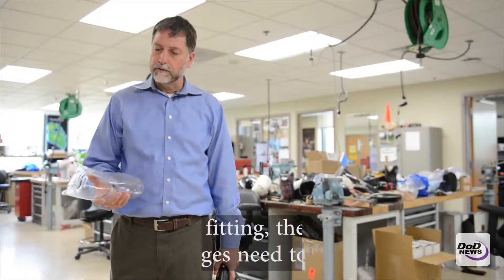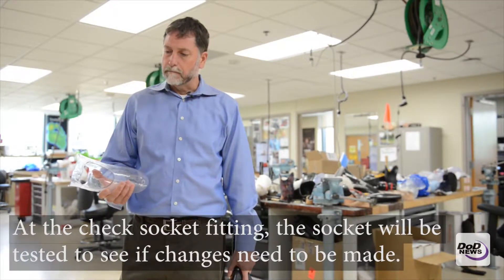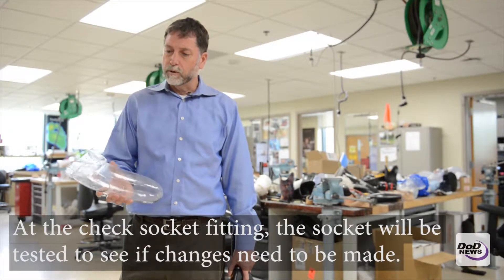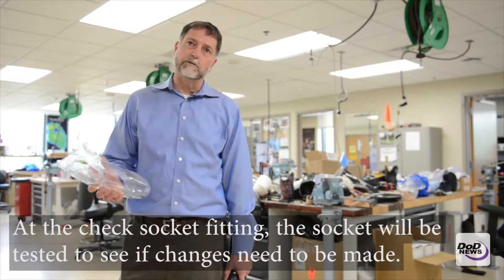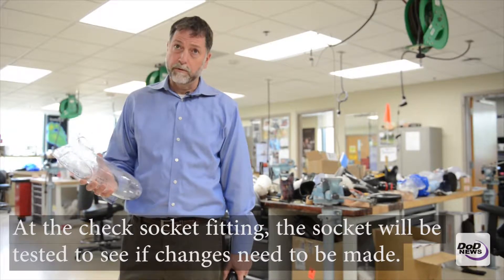This is a thermoplastic socket for an upper extremity trans-radial patient. We would do first a check socket fitting, and this allows us to make sure the socket fits proper from the get-go.